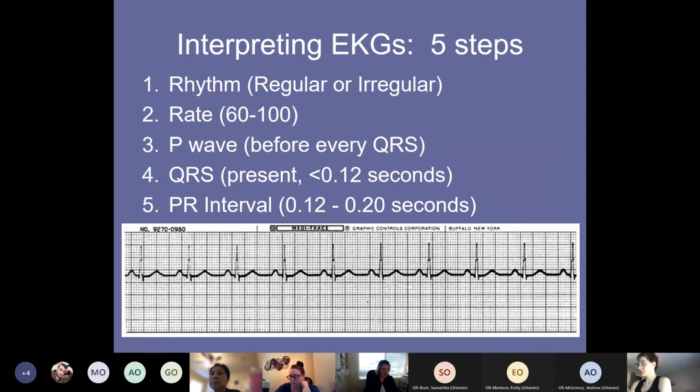This is a very important slide. I'd print this one out if you can, because this is what you're going to do when you're starting out reading EKGs. So I have mine even printed out right here, because when you look at a strip, sometimes you're like, where do I start? I like to try and find the most normal part of the strip first.